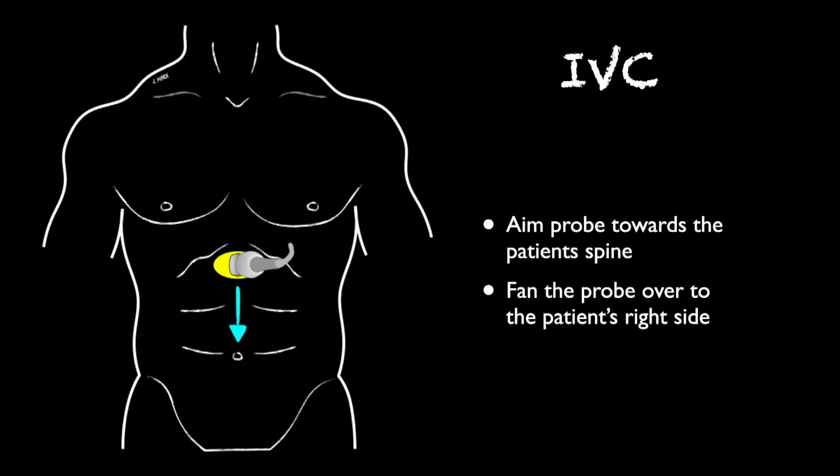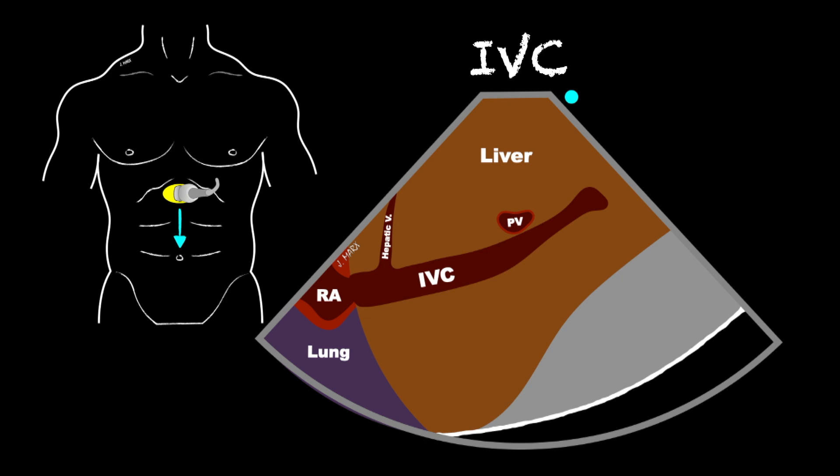From here, we're going to move forward to get an IVC view. All we have to do is start to angle the probe down, which gets us perpendicular again to the skin, and then fan over towards the patient's right. This will bring the IVC into view, and we'll get a view similar to this. We want to see the IVC traveling through the liver, and if we can, we want to try to identify that hepatic vein.